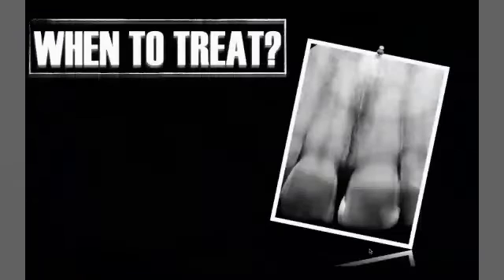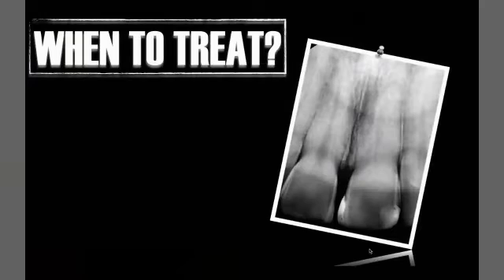Do you have any tips to increase the difference in terms of color between calcified tissue and dentin? Yes, we can use sometimes the canal detector, maybe red fuchsine, maybe methylene blue, just to differentiate the color. But usually, when you dry the pulp chamber, you will differentiate, and with a very high magnification, 16 or 20x, you will differentiate between the bright and the dark dentin.